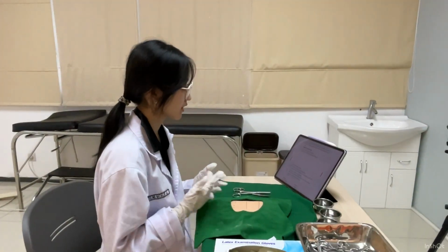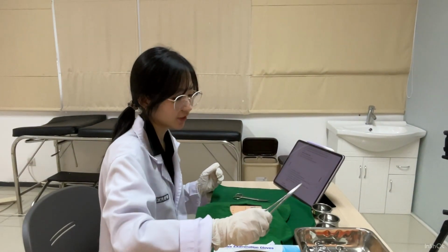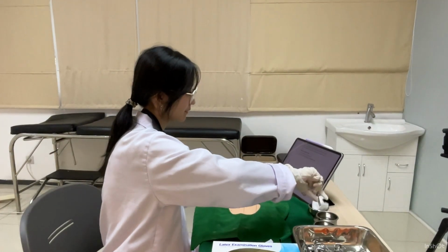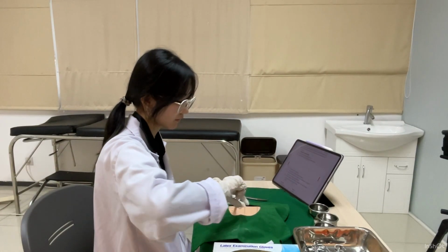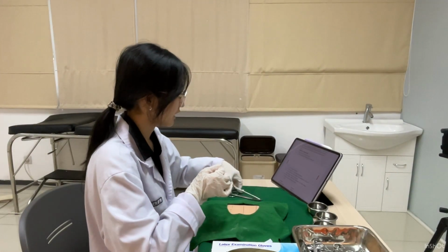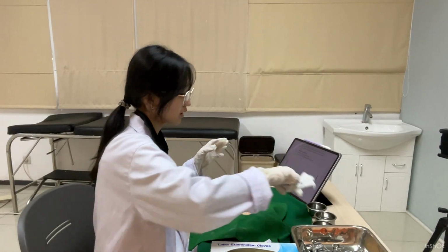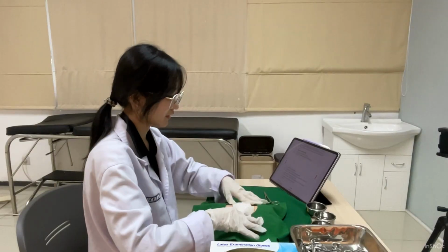Thank you. Okay, so next is for the surgical wound care. So I will clean the wound with the povidone gauze. So this is the gauze which I will dip in the povidone iodine. Okay, and I will cover the wound with a povidone gauze and a sterile gauze. So I'll dip another gauze in povidone iodine and I will cover the wound.